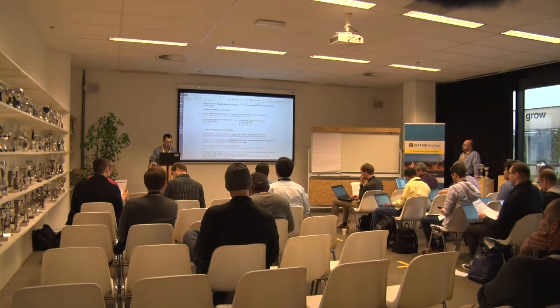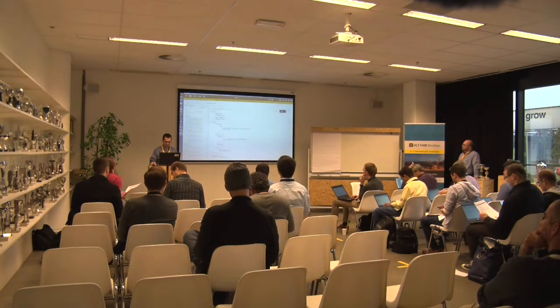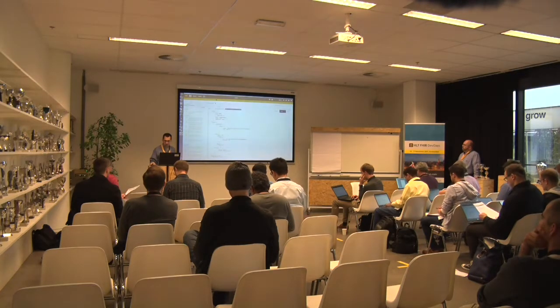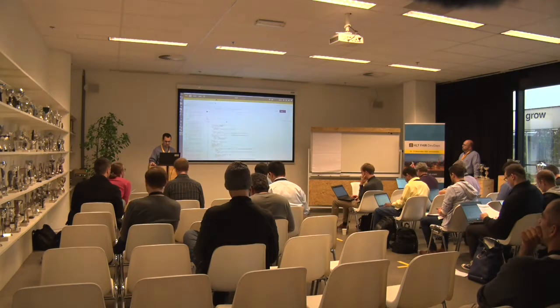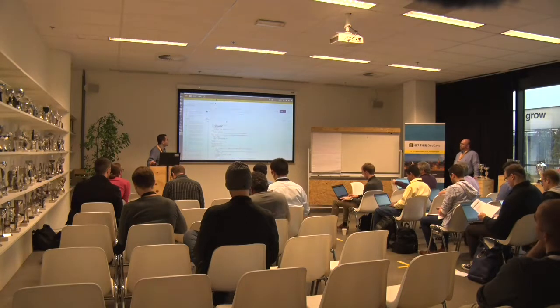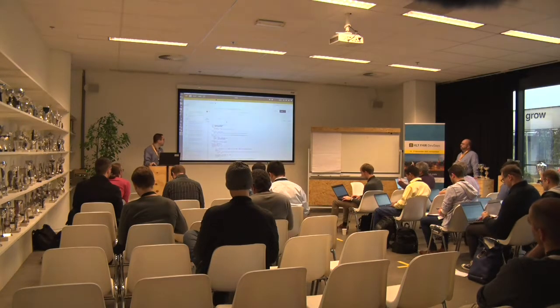Okay, now let's take this and actually see some information. So, I've only done one thing here. I've replaced my URL at the very top, and now I'm using the imaging study URL. Okay, so let's do a send on this one. So in here, again, it's relaying the information to me that I'm asking for an imaging study resource type. There's the ID. Again, the ID lines up with the accession number in the DICOM.